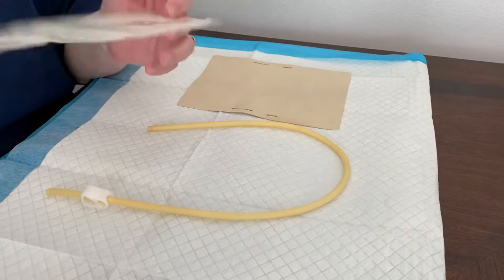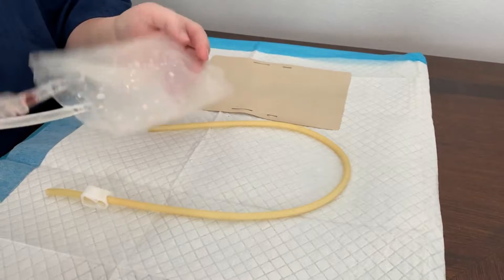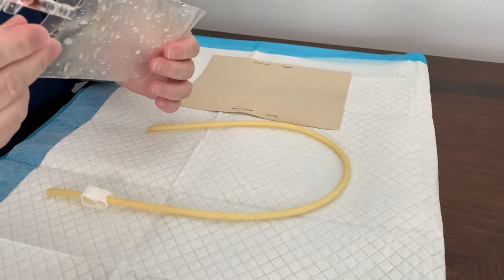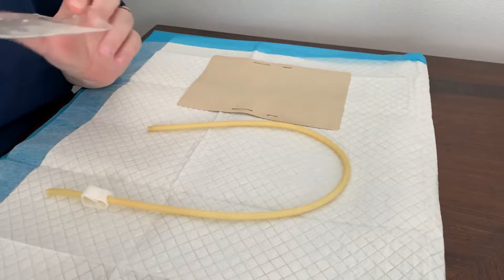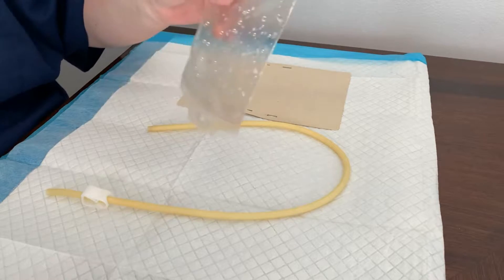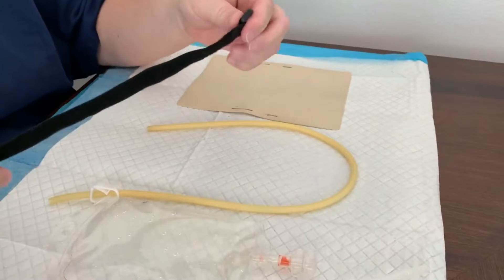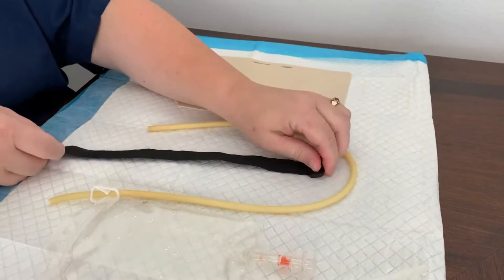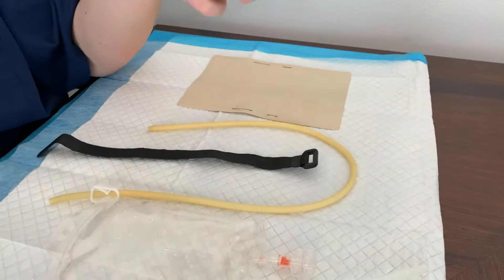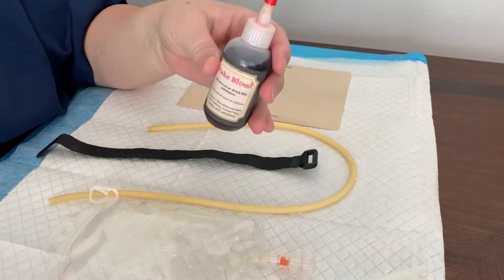You'll want a bag for your fake blood to go in. These are a Halloween prop, like a party favor — a blood bag you can drink out of, but it works perfect for this. This one I just recently used and rinsed out, that's why there's liquid already in it. You'll also want a strap, and you'll need your fake blood, or you can use Gatorade or any other red liquid.